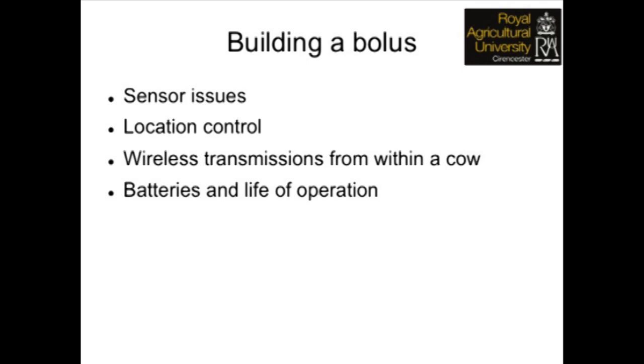I'm not sure how well that worked, but the alternative is to make your bolus heavy. So this weighs about 200 grams and has a specific gravity of about 2, and that means that it's as heavy as a stone and goes to the bottom of the reticulum.